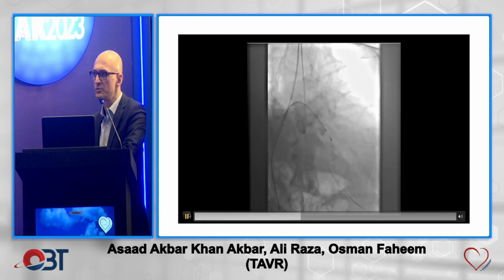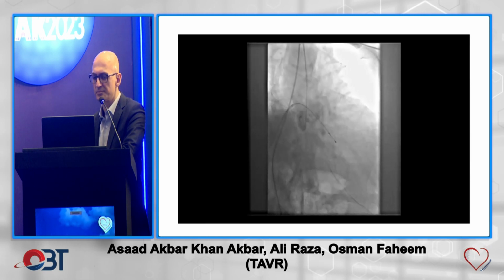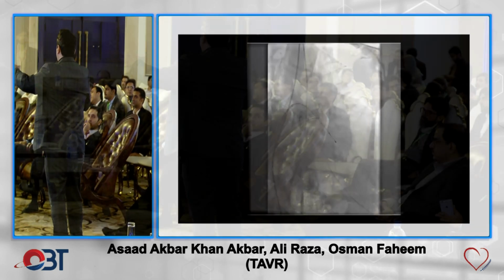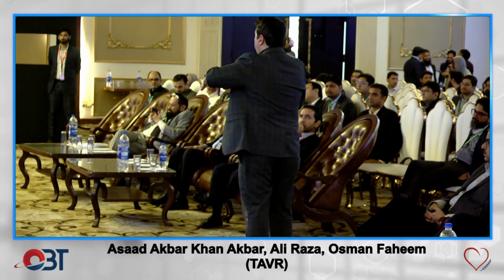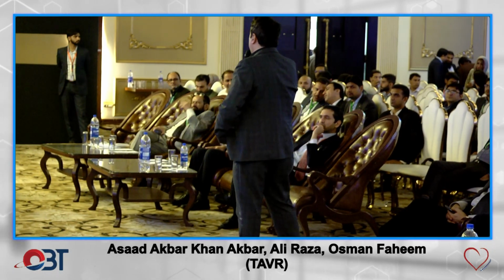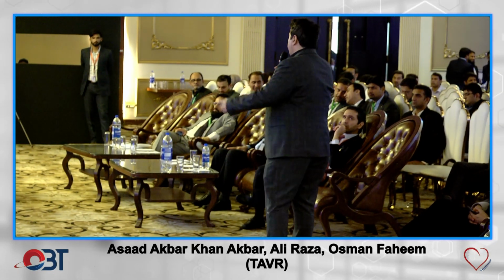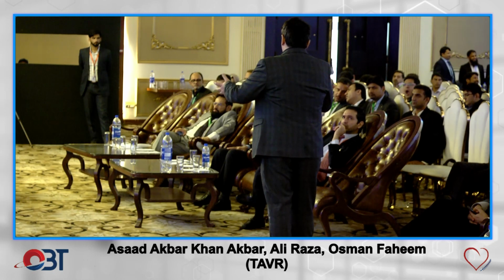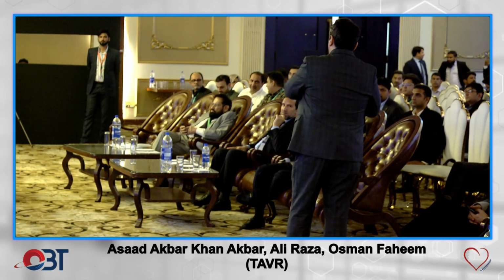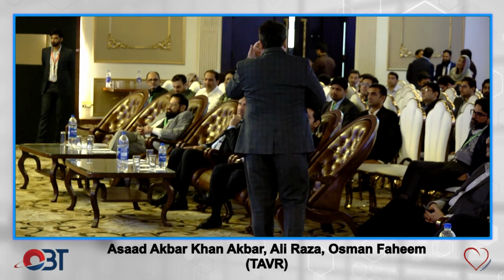I know, Ali, you use the LV wire for pacing. I always use the LV wire in my center. If I'm proctoring, it depends on whether the station is happy to use the LV wire. I'm a big favorite of LV wire pacing and not temporary wire pacing, because for self-expandable valves, usually this is enough. For balloon-expandable valves it's different, because you want to rapid pace at the very end, and you don't want to miss it.